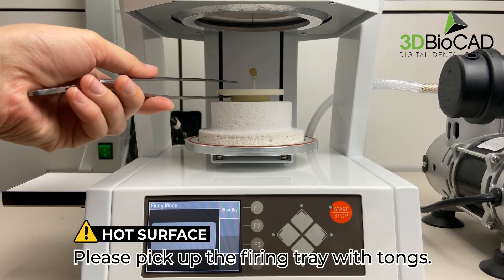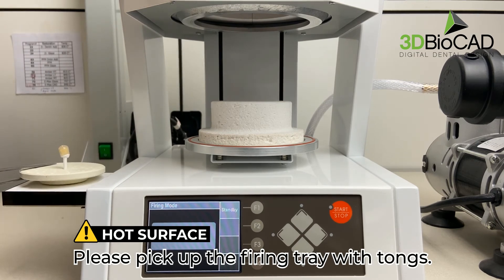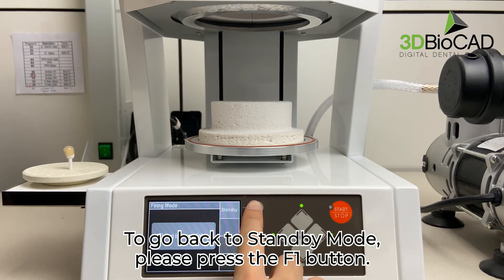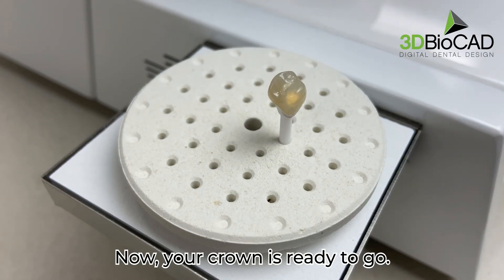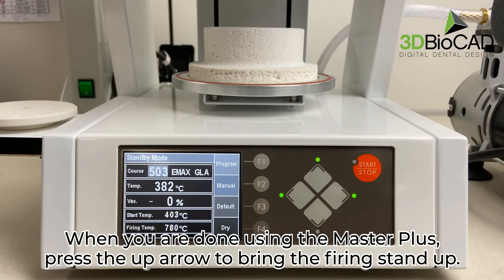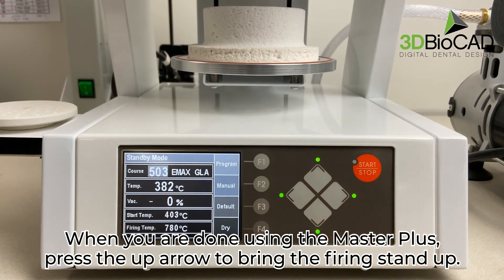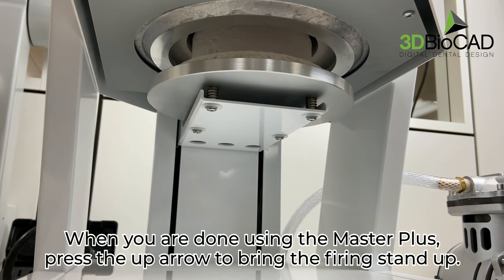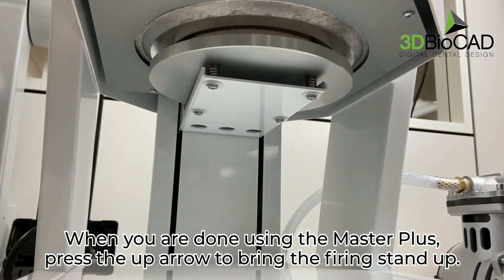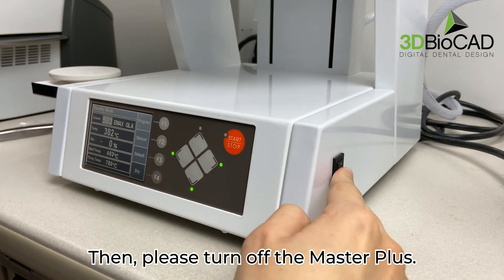Please pick up the firing tray with tongs. To go back to standby mode, please press the F1 button. Now, your crown is ready to go. When you are done using the Master Plus, press the up arrow to bring the firing stand up. Then, please turn off the Master Plus.